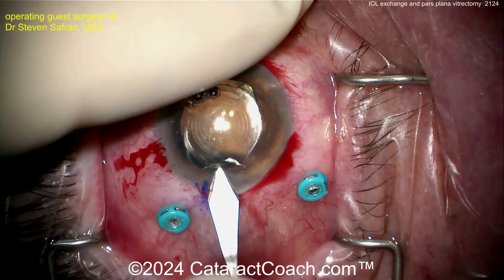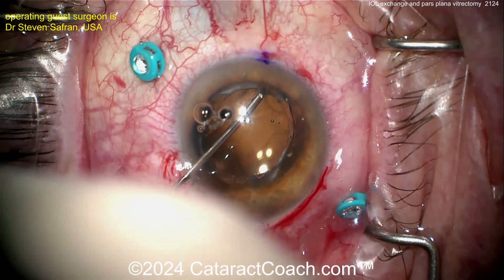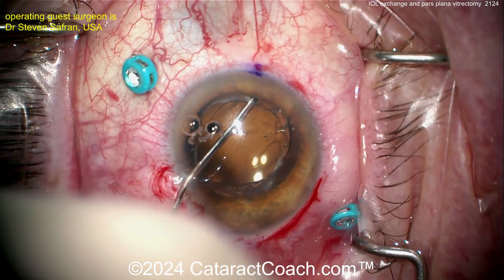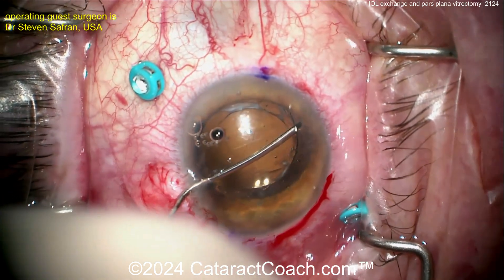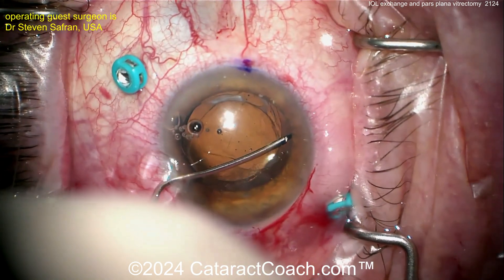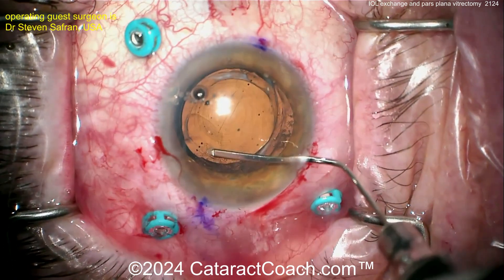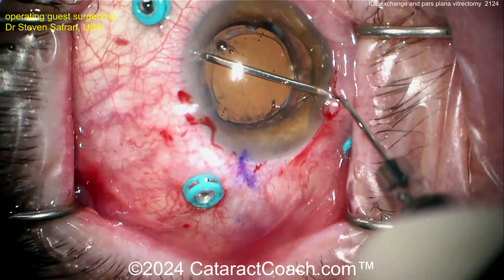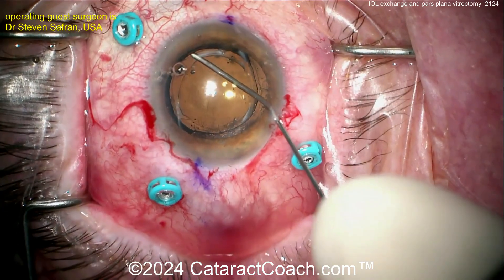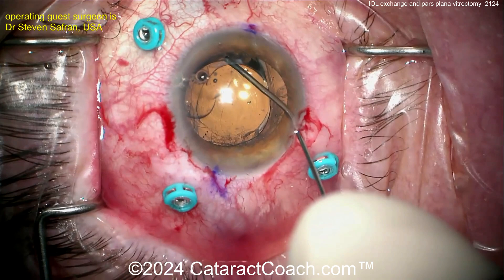You can see he's marking off a steep axis there and getting an incision made. Not sure exactly when this cataract surgery was done, but the key here is to be very careful in dissecting that lens out of the bag. The posterior capsule is still intact, and you want to be able to reuse this bag and get the new lens back in the bag as well. This looks like a toric trifocal lens, and viscodissection is the name of the game here.